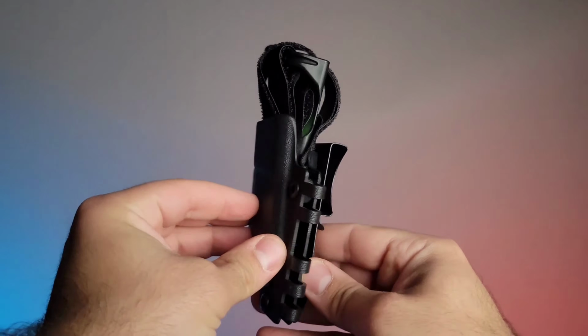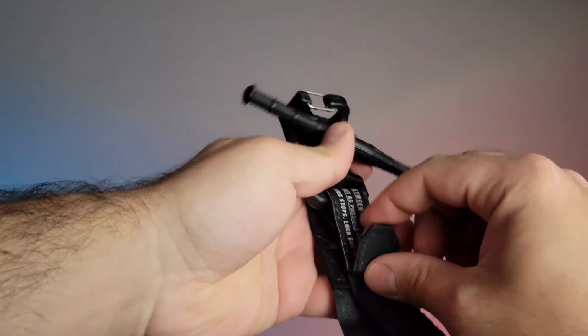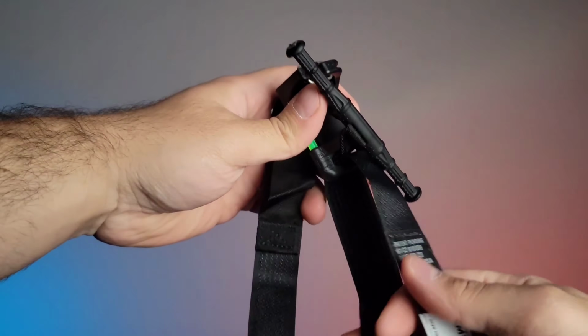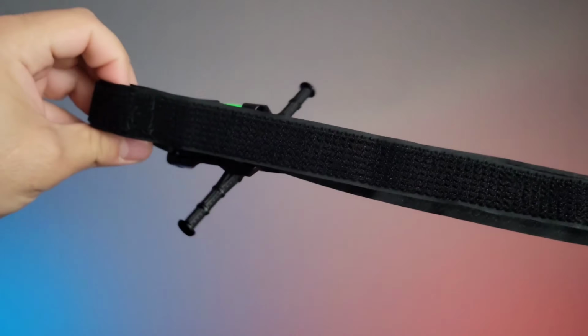Now, in regards to the actual function, there are a few things I noticed off the bat. First of all, the way it's shaped and the way they fold it, it's very compact and easy to use. You simply pull the strap and it opens up all the way, and then there's the tab that's able to open it. One of the first things I ran into, which I'd consider, is that the webbing they're using is just webbing. There's no durability to the webbing itself. What I mean is that when you're applying it, let's say to an arm, you really need to make sure it doesn't wrap over on itself, because if it's twisted, you're going to have a tighter point where it's not going to function the way a tourniquet's supposed to function.